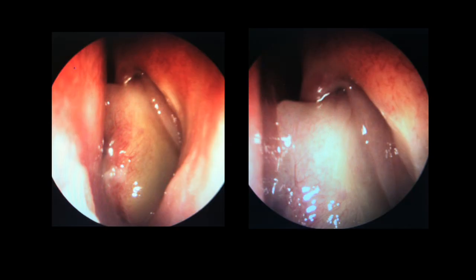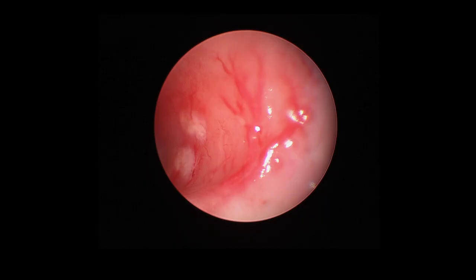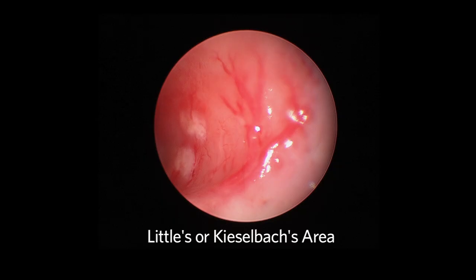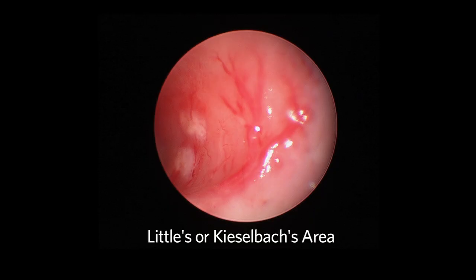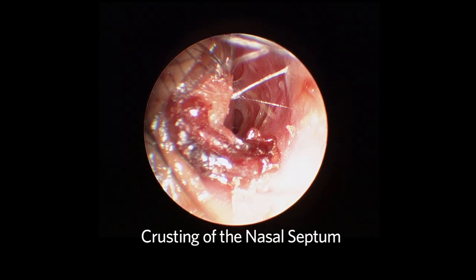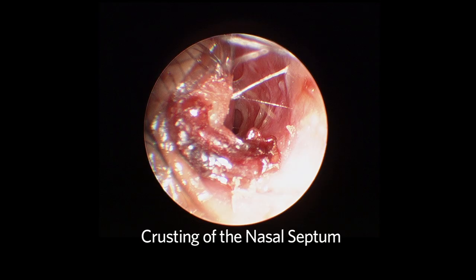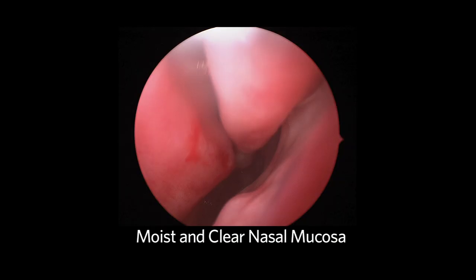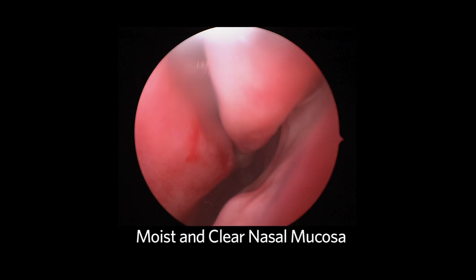Occasionally on examination, one may see nasal polyps emanating from the area of the middle turbinate. On the anterior septum, you often see vessels in the area known as Little's or Kiesselbach's area. This is a common site for epistaxis. One may see crusting of the nasal septum, the nasal vestibule, or the anterior aspect of the inferior turbinates, which is suggestive of infection. In most circumstances, the nasal mucosa is moist with minimal discharge, which should be clear.